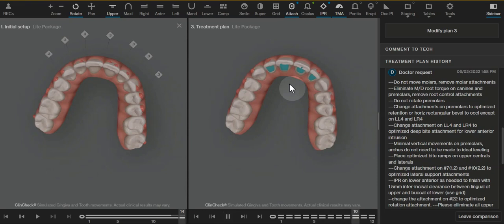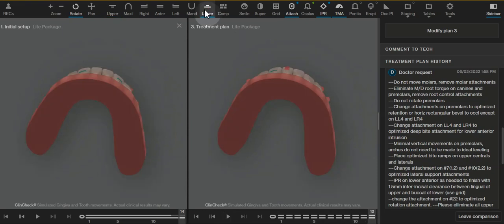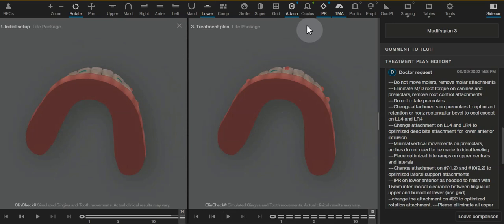We add bite ramps so that we can prevent posterior open bite from the molars passively intruding from each other throughout treatment.